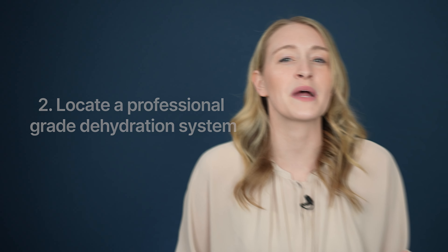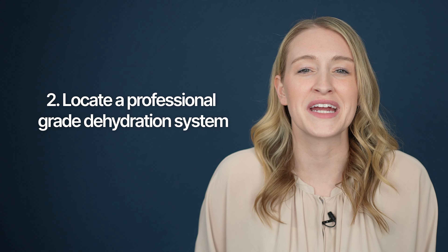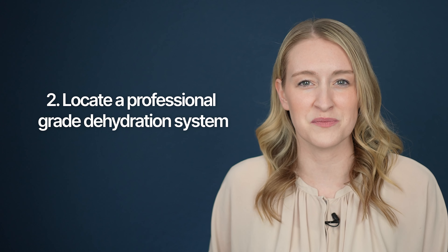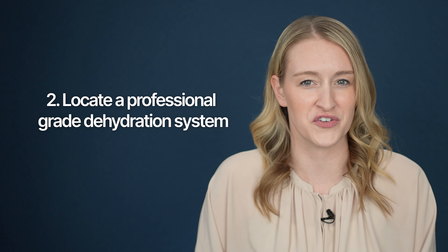I definitely recommend at-home dryers for all hearing aid users since they're relatively cheap and easy to use. However, in the instance that your hearing aids got really wet, these systems are unlikely to cut it. This brings me to the second way that you can dry out your wet hearing aids, which is by locating a professional-grade dehydration system. Professional-grade dehydrators use alternating heat and vacuum cycles in order to pull out every last drop of moisture from your devices.